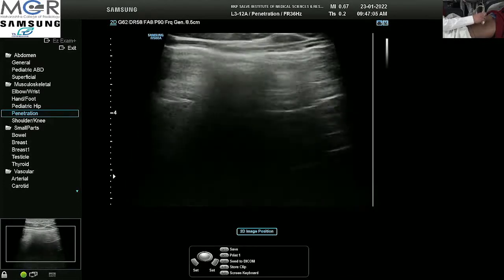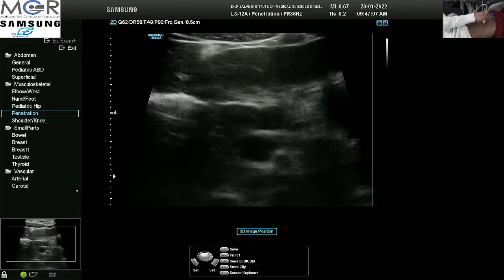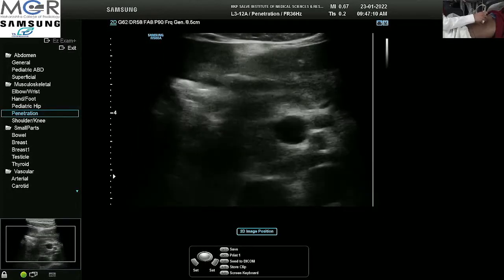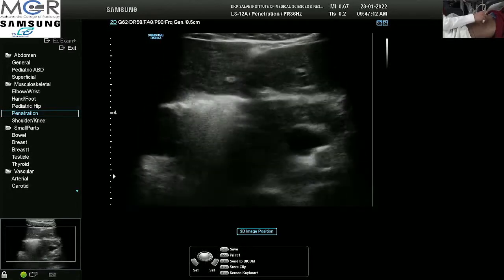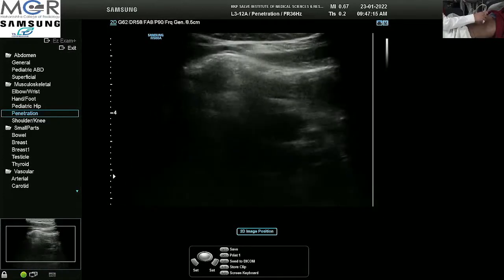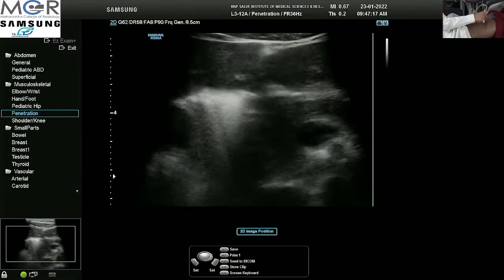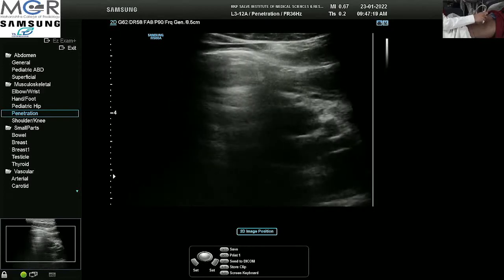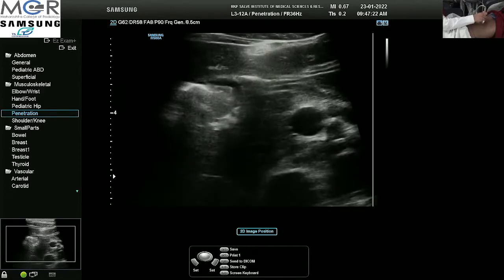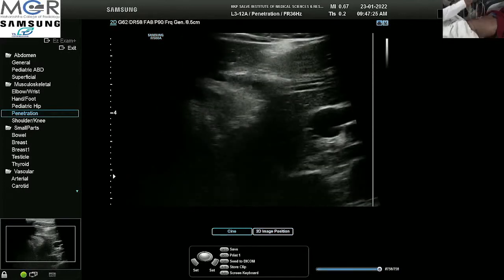What I do is trace the stomach, and where the lumen narrows a bit, that is where the pylorus starts. I will ask the patient to move into a right decubitus position so that we are able to see the pylorus better.